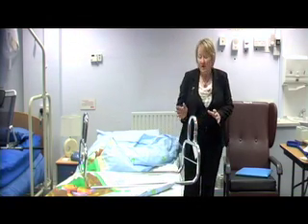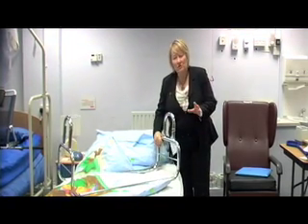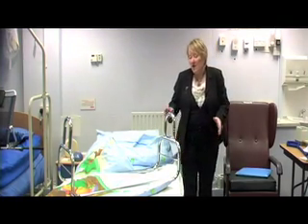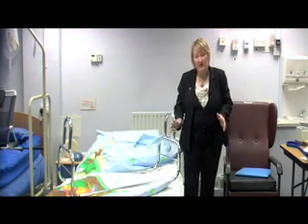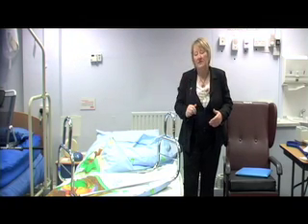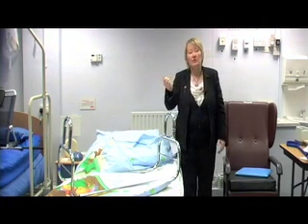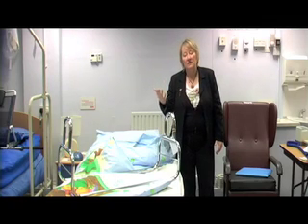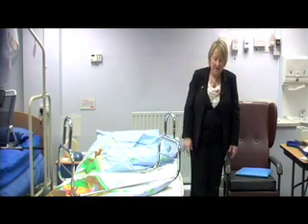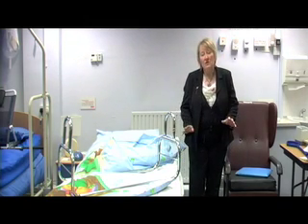There's an enormous amount of literature about entrapment, and I'll tell you a story about the beds that we don't issue in Croydon. What happened was that somebody fell out of bed. It was an up and down bed, but once you hit the down button, it continued. Often what we would do is we would press, and if you release the down button, then the bed will stop. But this didn't happen. The person fell out of bed, they hit the down button on the bed as they went down, and they lay underneath the bed, and they were crushed.